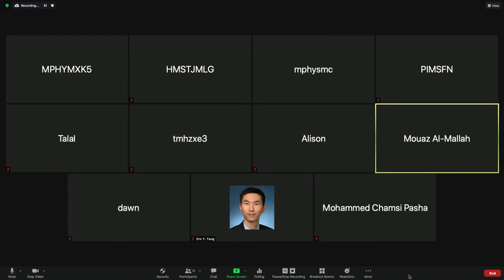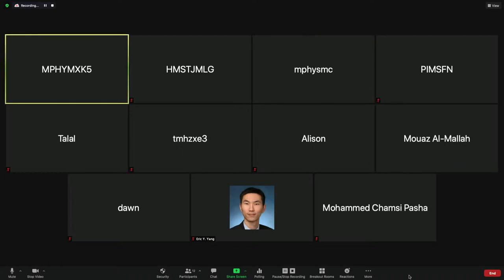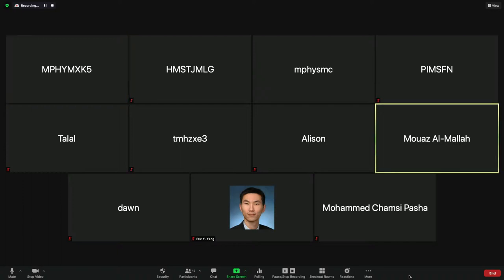Sure. Can you hear me well? Yes, we can. I think we started to do PET for LVAD infections recently. It's a very valuable tool when you are in doubt or trying to localize the infection or assess response to therapies. For many of these patients, it's very helpful, because these patients are usually sick and could get infections elsewhere, but the concern is always whether they had an infection in the LVAD or any of its connections.